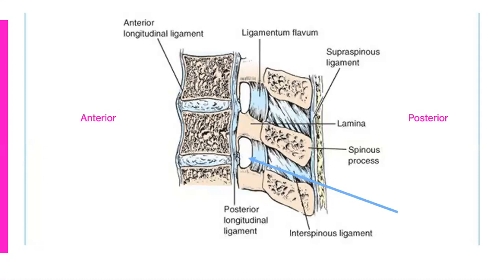This is why, initially when you are inserting your needle, you should always try first for the horizontal trajectory, which is perpendicular to the skin. And then, once you find that you are struggling, slightly angulate your needle cephalad towards the patient's head.